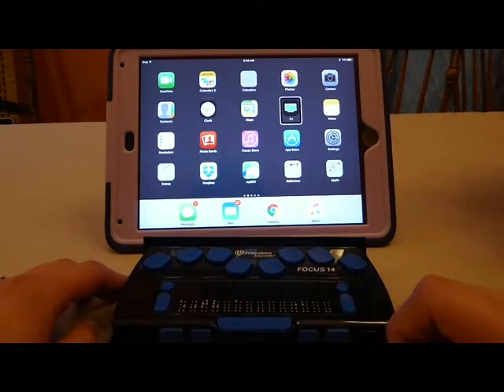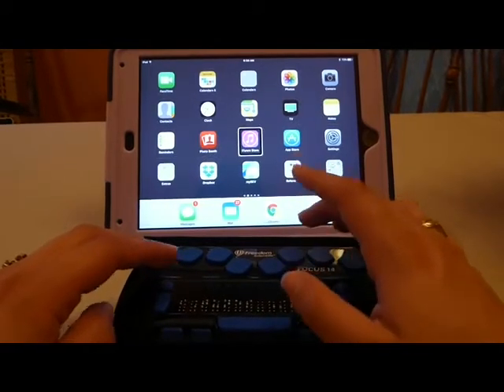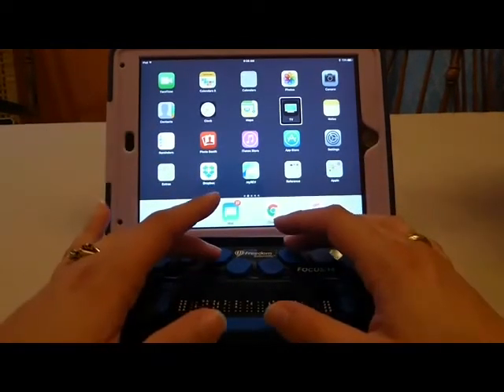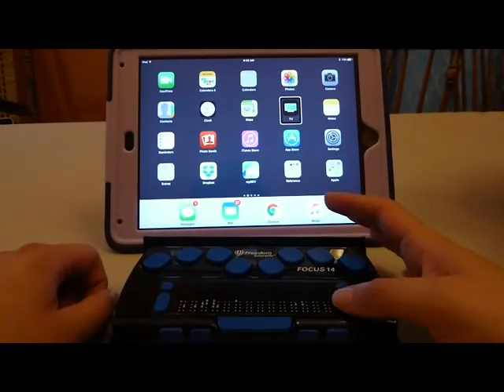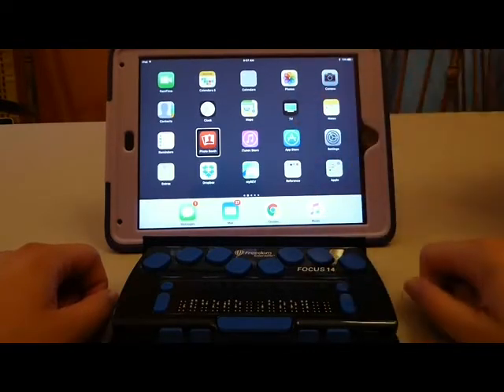Or on all Braille displays, you can use the same commands or Braille chords. So dot 5 and space will move me to my next item. Dot 2 and space, for example, will move me to my previous item. To compare, I needed to use two hands and a space bar to be able to move efficiently through my items. Whereas if I'm just using the nav rocker on the Focus, all I need to do is use one finger. That's why sometimes using the dedicated buttons on the Focus for actions on the iPad can be helpful.